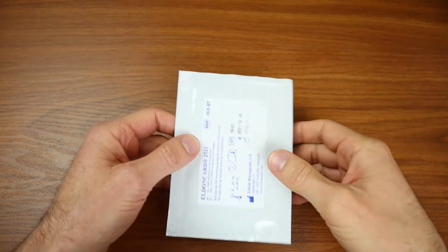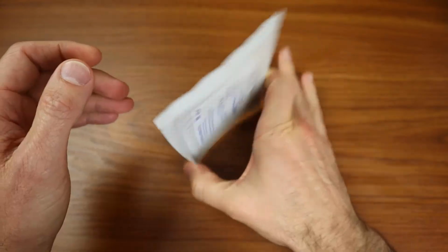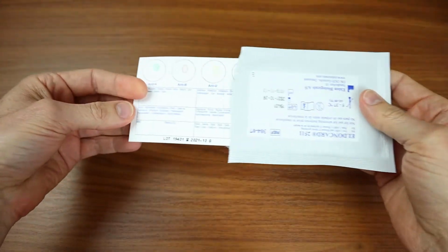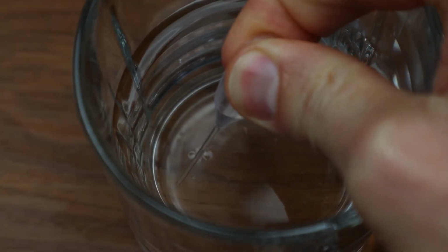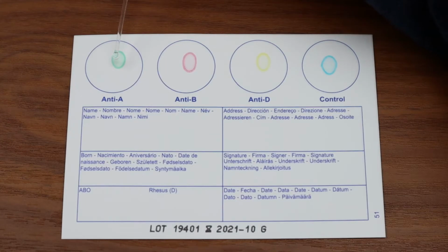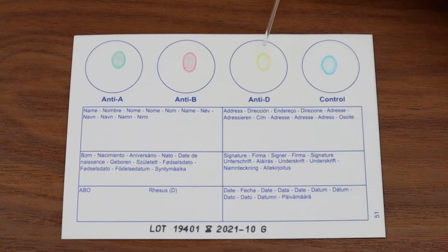Next, carefully remove the Eldon card from the protective wrapping. Find the perforated corner, tap it on a table to make sure you don't accidentally tear the card, open it up and pull out the card. Now grab your pipette and suck up some water. Place a single drop of water on the colored spots on each one of the 4 circles. Be careful not to let the tip of the pipette touch the card.